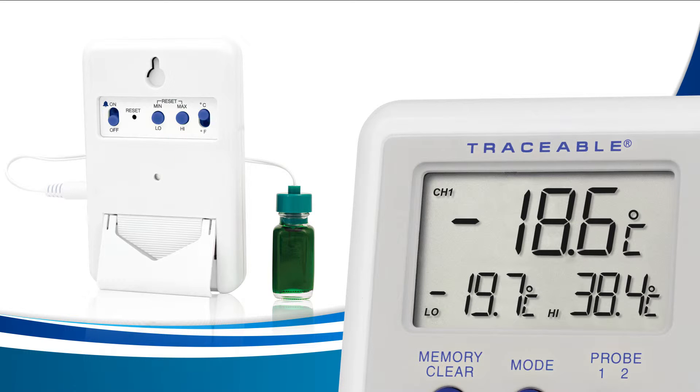If you pass the number you need, keep increasing the value until you reach the max temperature range of your device, which in this case is 70 degrees Celsius. Once you try and exceed 70 degrees Celsius, the number will drop to the lowest your device can read, which is negative 50 Celsius. Continue increasing your value until you arrive at the one you need.